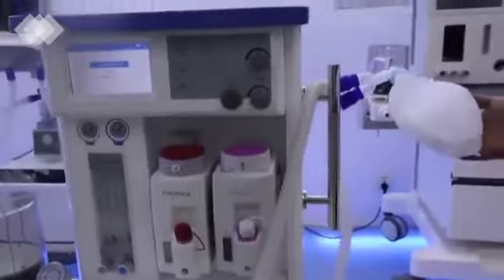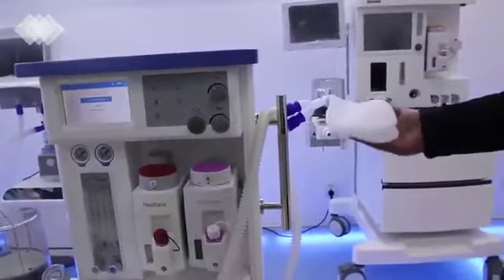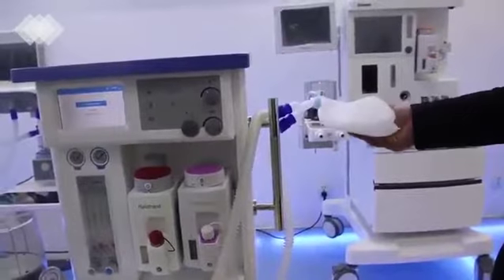Here is the bag. For the breathing bag, we have 4 types in total: 0.5 liters, 1 liter, 2 liters, and 3 liters. Usually for the baby, we use the 0.5 liters, and for adults, we use the 2 liters or 3 liters.